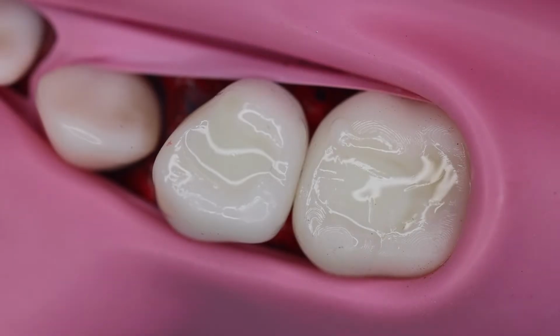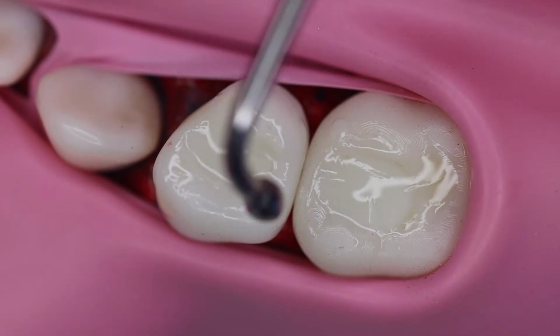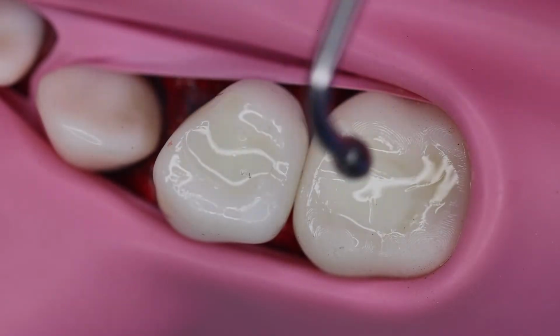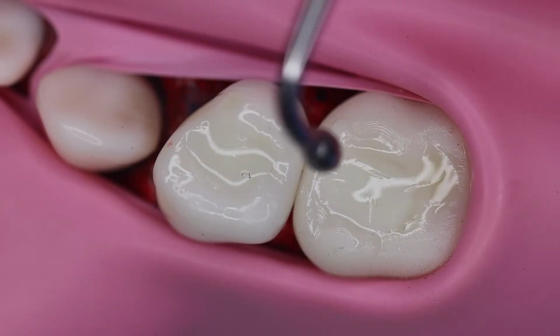Hope you were able to understand the concept of using this type of restorative. We have a good pedo shade, good restorative ability, and the additional feature of bioactivity.